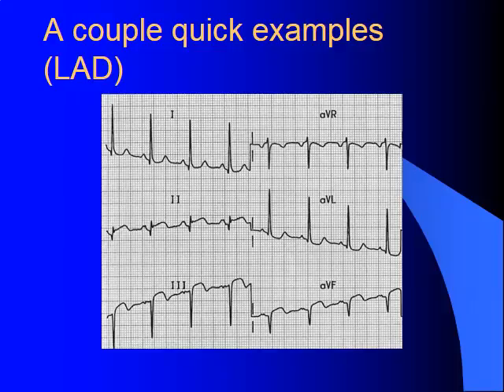So then we look at AVL. If you look at the ends of the lines on AVL, you'll see that one is plus 150 and the other side is negative 30. The way that we're going to tell which number our axis is, is by determining if AVL has a more positive or a more negative deflection.